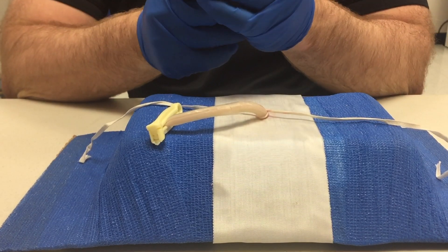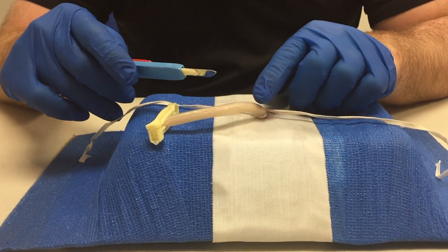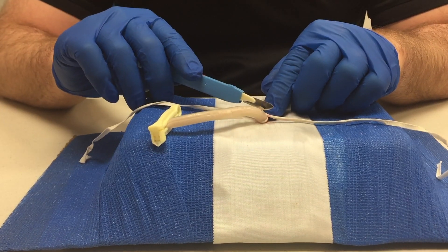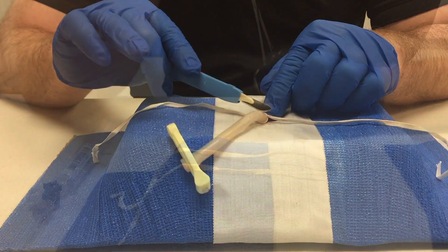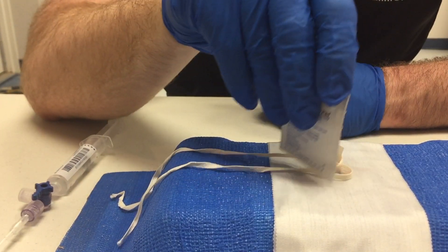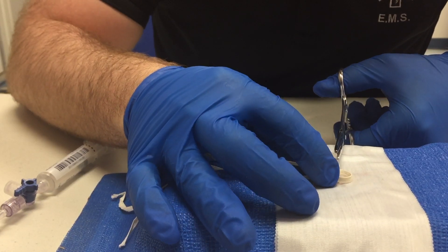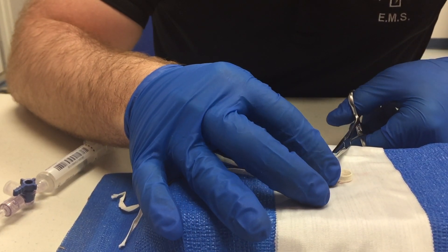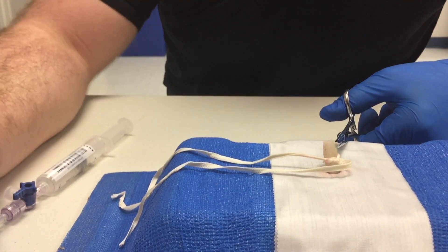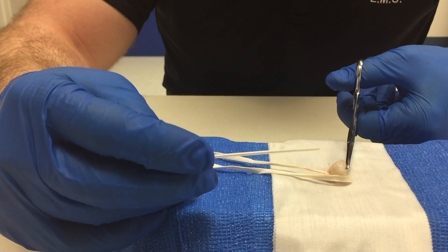Now the paramedic will use the scalpel to cut the umbilical cord approximately one to two centimeters from the infant. Next, the paramedic will clean the umbilical cord and the area around it with a betadine swab, and then attach the hemostats to the edge of the umbilical cord to help stabilize it while he inserts the catheter into the vein.